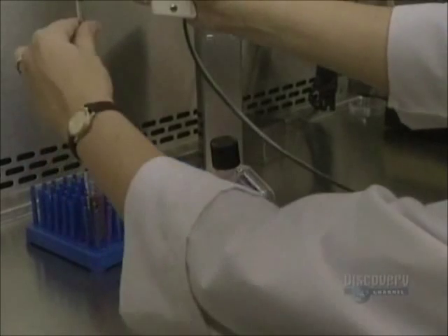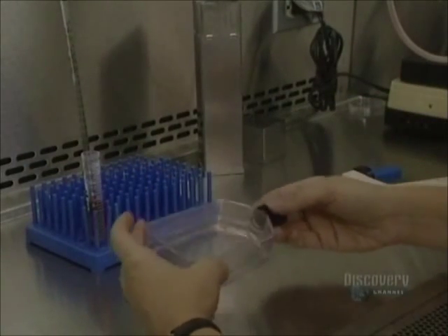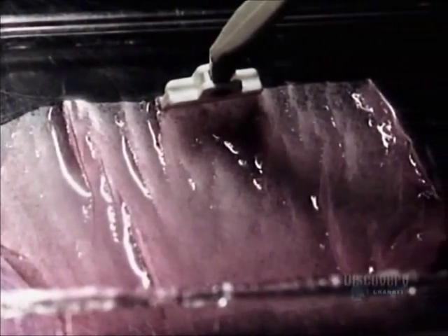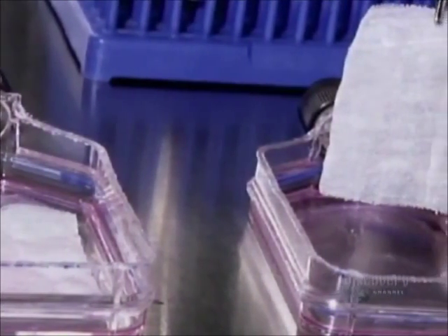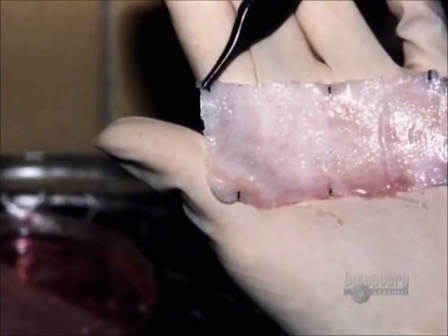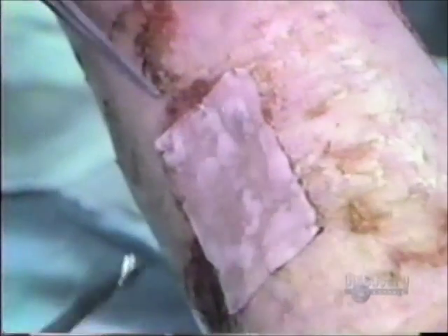Skin strips coat the inner surface of the flask and are then detached with a spatula. The flasks are cut into with a heating unit resembling a soldering iron. To make handling easier, gauze is placed on the skin strips, whose thickness is less than one-tenth of a millimeter. The graft is placed on the wound with clamps, and the gauze will be removed after 10 days. A patient can be skin grafted in less than two weeks.